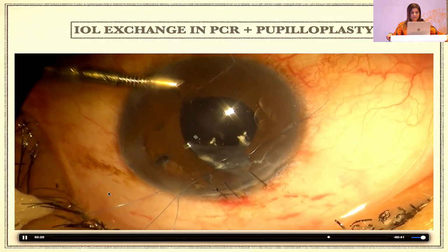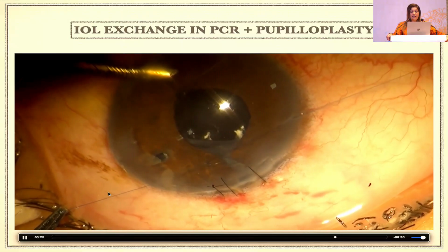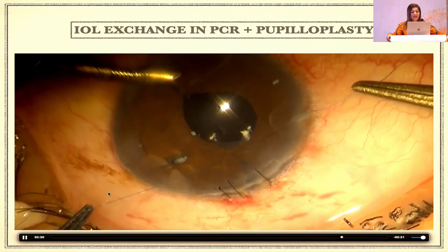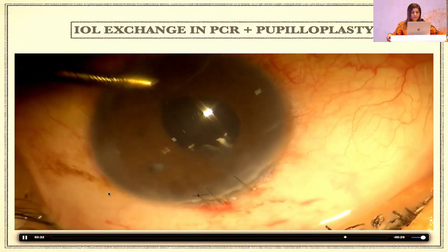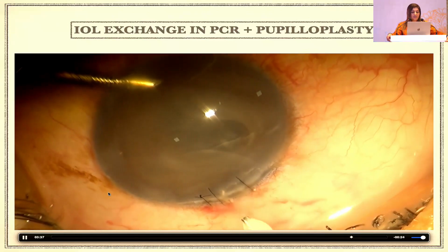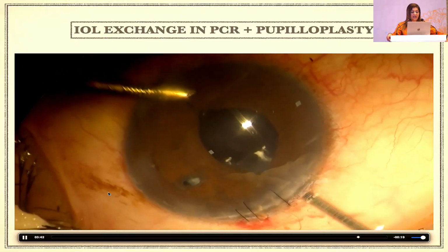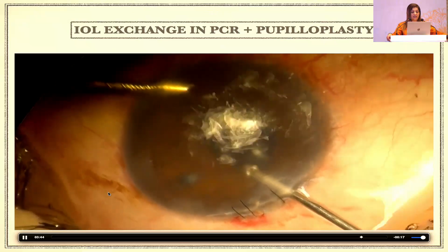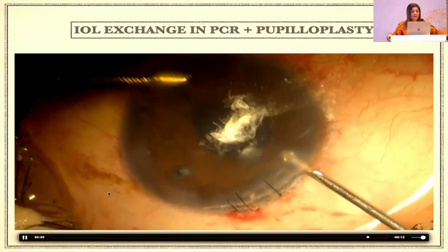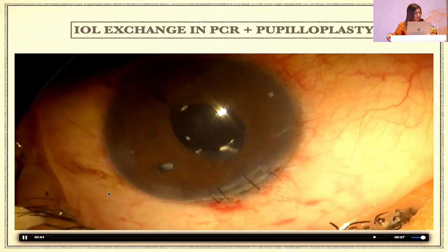So this is the single pass 4 throws, always taken in the same direction, and then you just pull both the suture ends, and then it beautifully slips inside, and you can just cut them off. You take up an end opening scissors or a long arm scissors, whatever you have in your system, and you can cut that suture. Always stain. I have a habit. I always use triamcinolone at the end, and always make sure that everything is going okay inside the anterior chamber. So these are some of the things that I would just like to share.